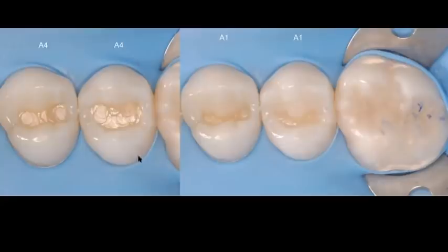So once you place your horizontal layer, you condense it very nicely, you smooth that layer, and you light cure. Once you light cure, then we go to the next step, and you can see it on the right hand side. What I'm going to do now is build every cusp individually. I'm starting with this small tooth because it's easier for me to explain this technique by looking at a small tooth. But I'm going to share with you all kinds of clinical situations today.